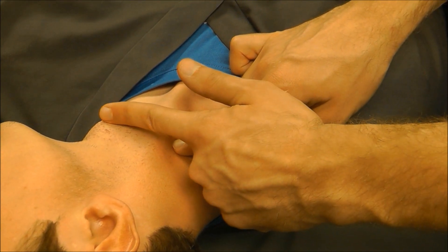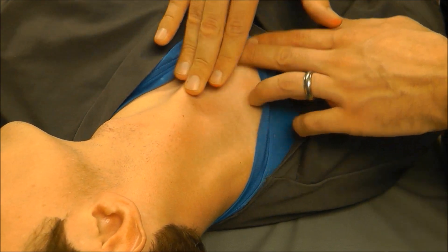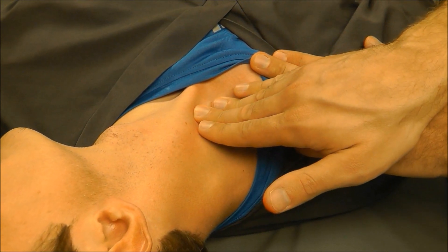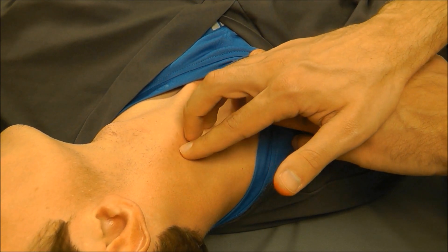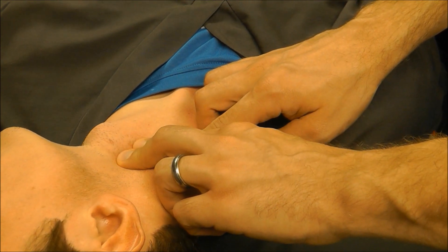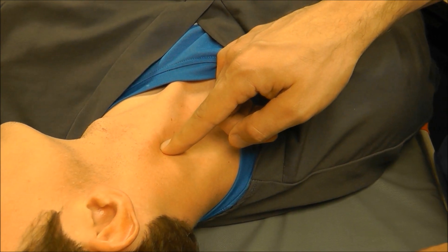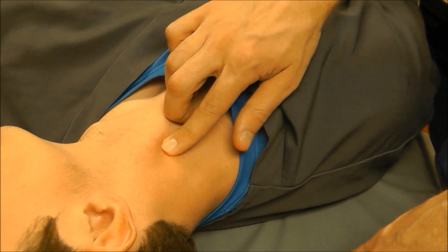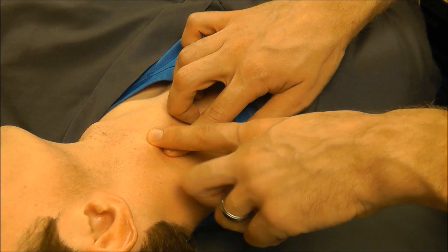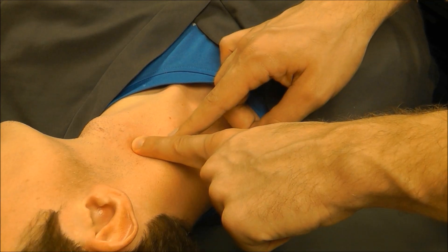This should be lateral to the thyroid cartilage. You can usually get to those landmarks from the sternal notch — go about three fingers over, three fingers up, maybe a little bit higher. You also want to make sure you are palpating a carotid pulse and that your insertion site is lateral to the pulse. Some people don't even find the apex of the triangle — they just go lateral to the thyroid cartilage and make sure they're lateral to the carotid pulse.